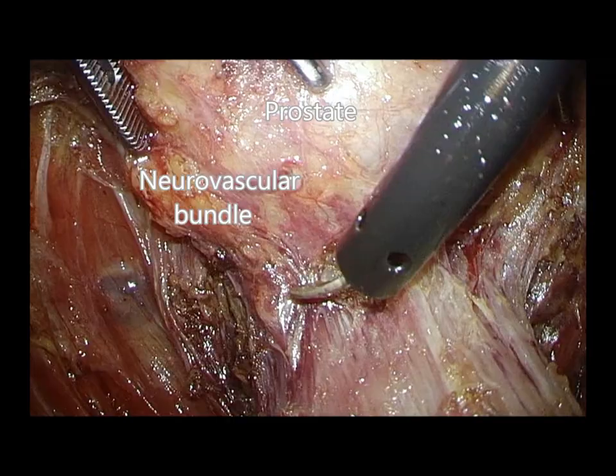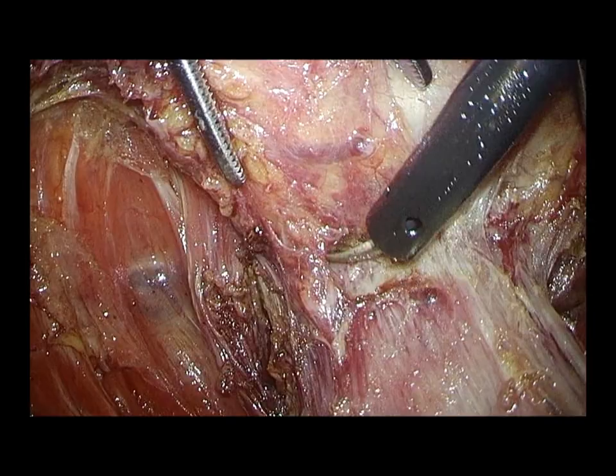This is the most distal part of the rectum. The prostate is exposed and the neurovascular bundle further approaches medially.